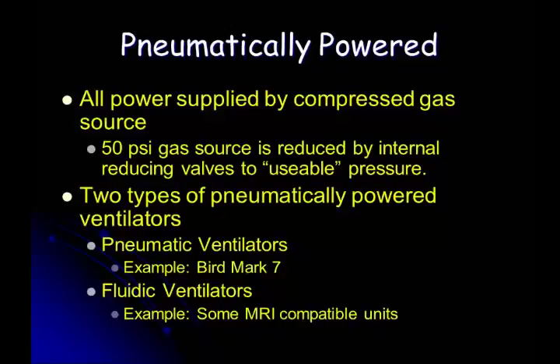True pneumatic ones you've already used. The Bird Mark 7. That's a pneumatically powered ventilator. Doesn't have a plug, right? Just plug it in the wall, a 50 psi source, be it air, be it O2, and it'll function. There are some ventilators that are also called fluidic ventilators, and these are rather cool because there's no moving parts. How the hell does gas move if there's no moving parts?